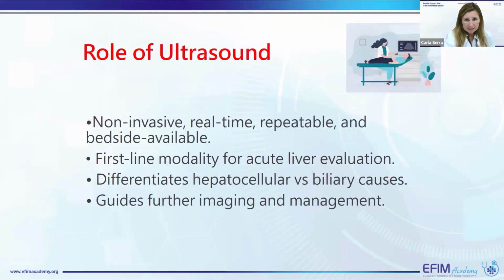And the role of ultrasound is so important for acute hepatitis because you know that ultrasound is non-invasive, real-time, repeatable, and bedside available. So usually, ultrasound is the first-line modality for acute liver evaluation, and it can differentiate between hepatocellular versus biliary causes.